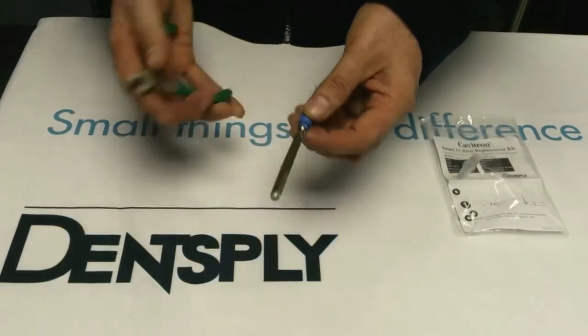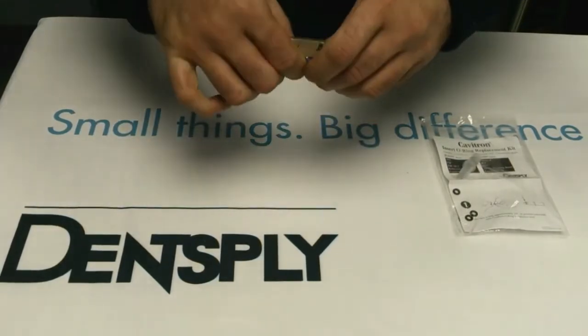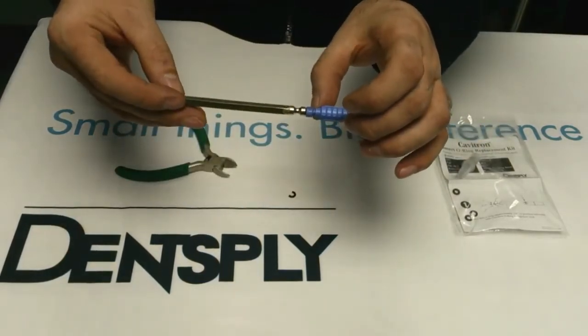This is a perfectly good o-ring which I shall just remove for demonstration purposes. Now you can see the annular that the o-ring sits in.